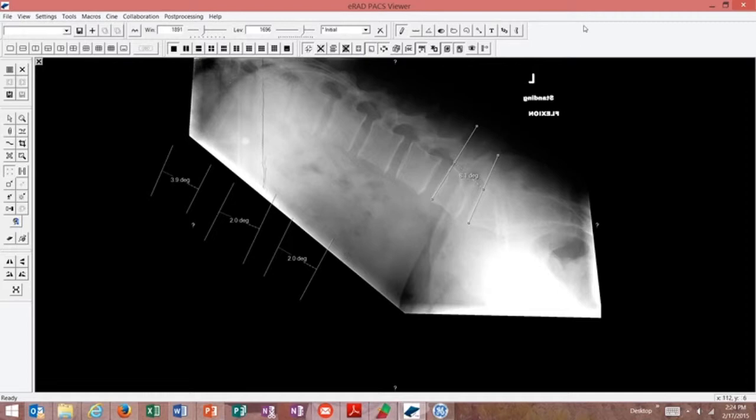They're going to somewhere connect back here. Okay, and we could measure that angle if we had enough screen space to go back to a point at which those two lines meet posteriorly. So that's L1, L2, that's L2, L3, L3, L4, L4, L5.